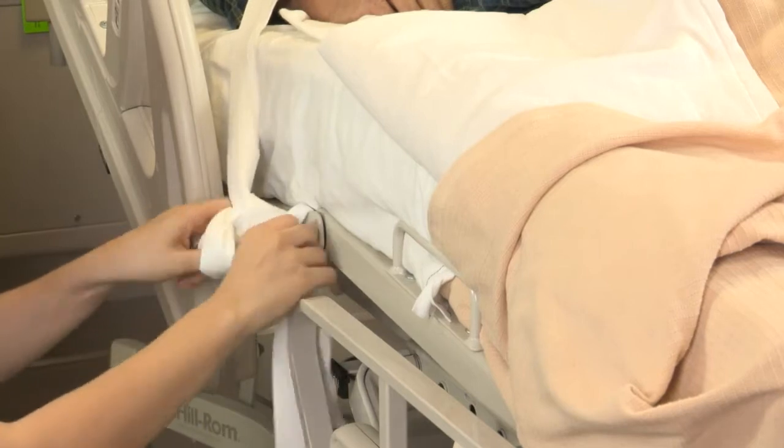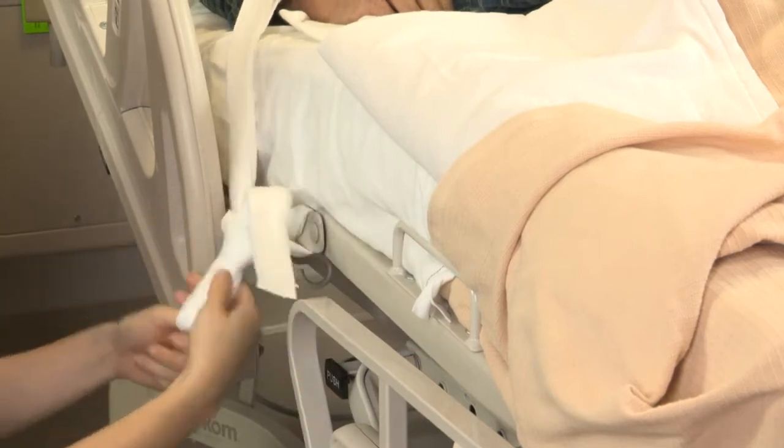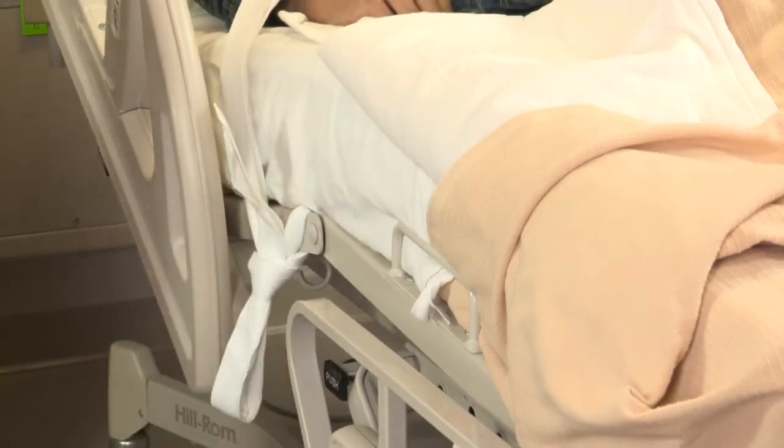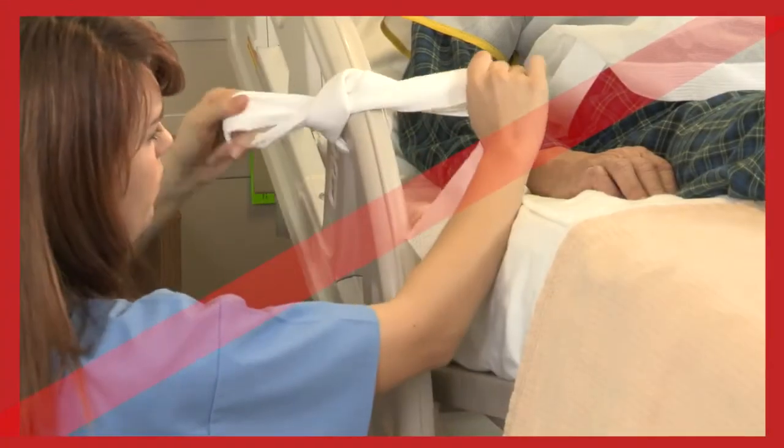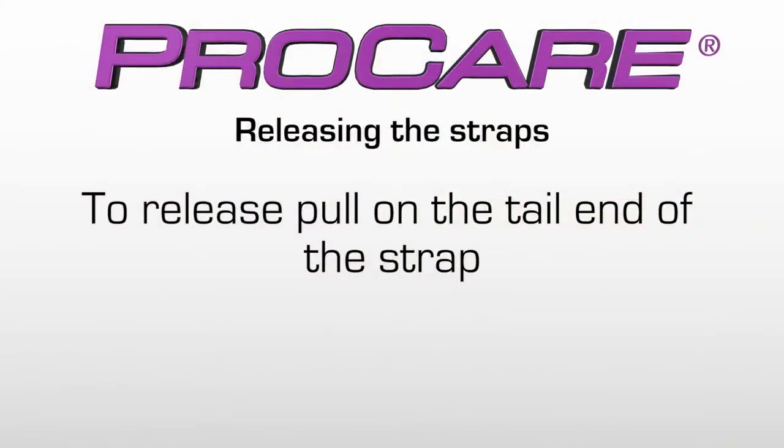Bring the second strap through the first loop. Pull to tighten and tuck any excess strap out of the reach of the patient. Do not attach to the side rails. To release, pull on the tail end of the strap.